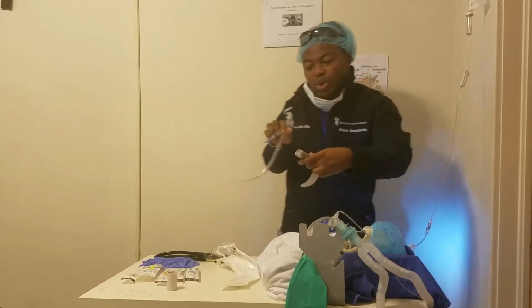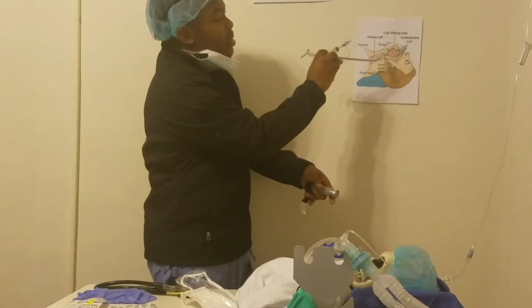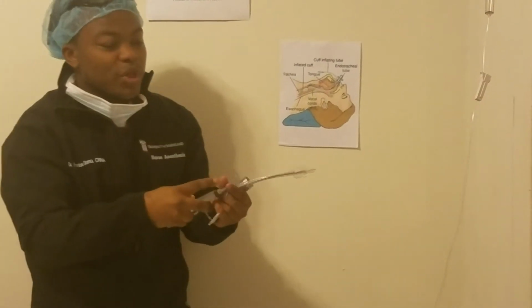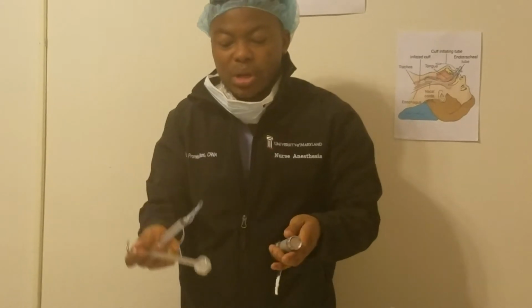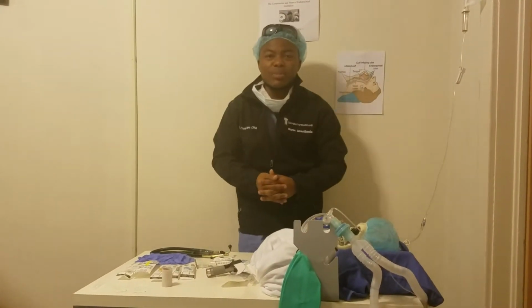And once we do that, the blade will come this way, we'll see a glottic opening and vallecula. We'll lift it up and we place the tube in there. Once we do that, we'll go ahead and inflate the cuff, which secures the endotracheal tube below the glottic opening. And then we tape the tube to the patient's mouth. And that's the intubation process.